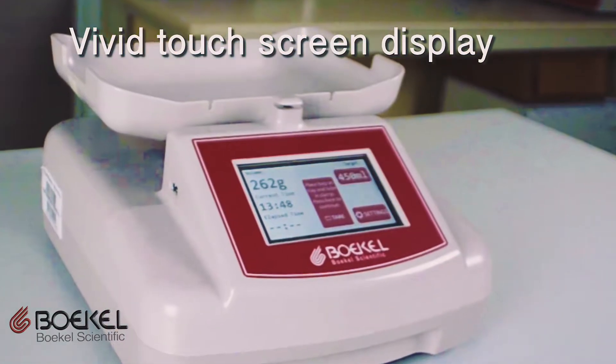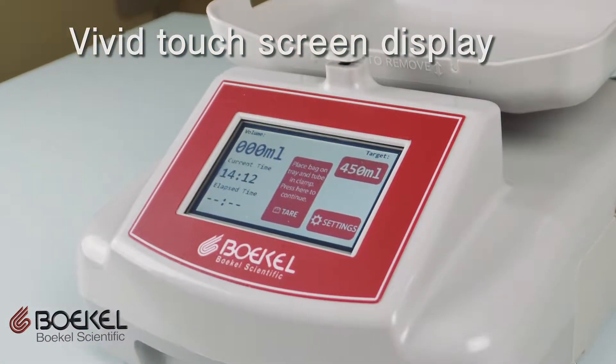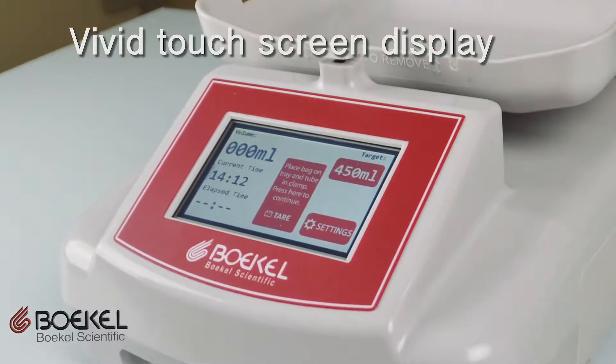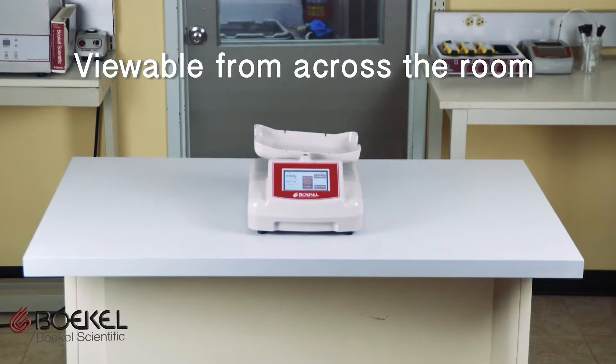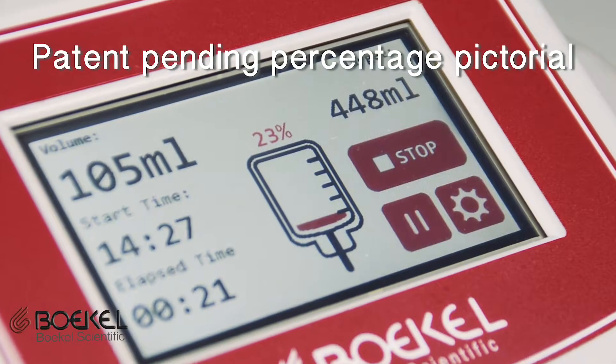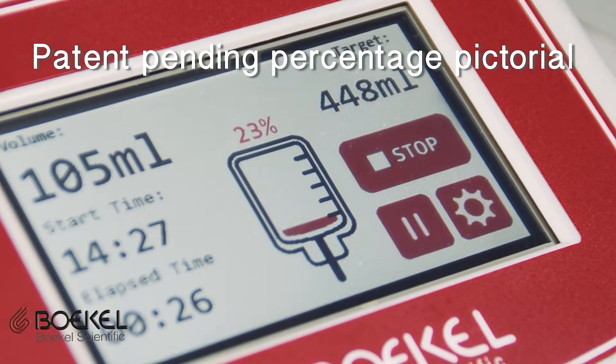The Touchscreen Blood Collection Mixer features an easily viewable bright color touchscreen that displays the most important collection data in real time. This visual representation can easily be seen from across a room. The patent-pending user interface design features a large pictorial indicating the percent complete.